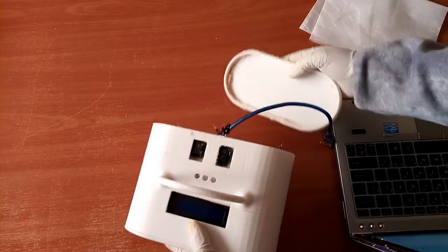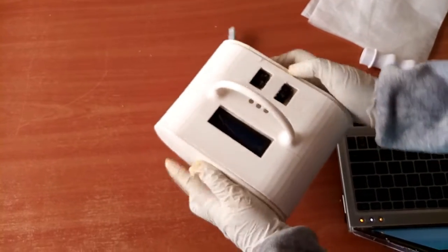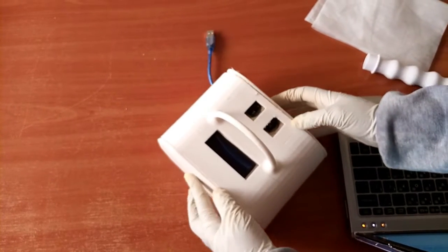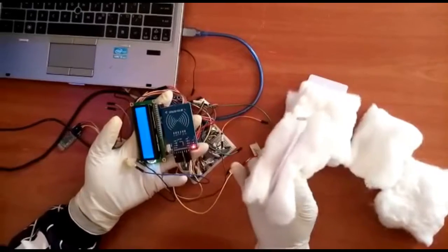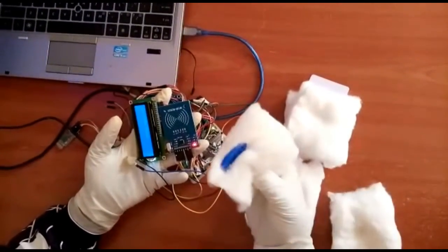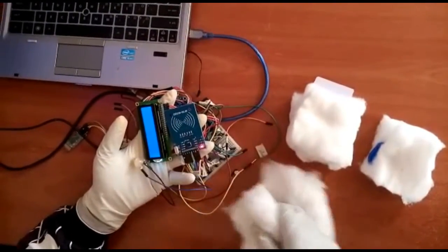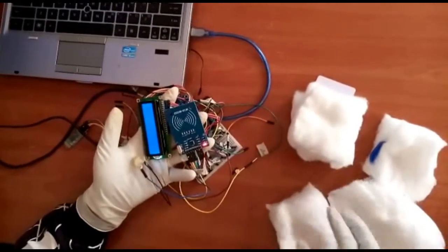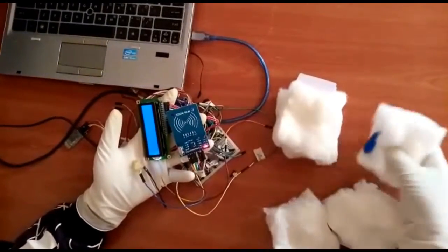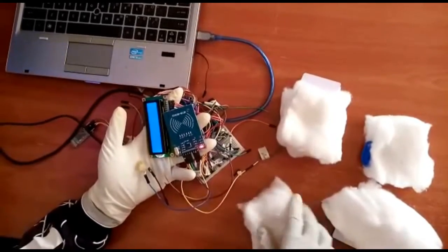So now we place this cover. Now from there, the doctor can scan. So after the procedure, the outer casing will be removed and sterilized. Before the final assembly of the device, we do some tests. So when we scan the sponges, the buzzer beeps, the yellow LED glows, the LCD writes sponge detected, and we do the same for the rest of the sponges to ascertain that they are working.